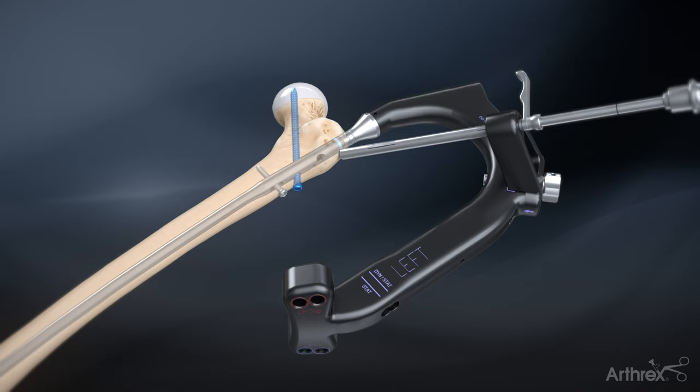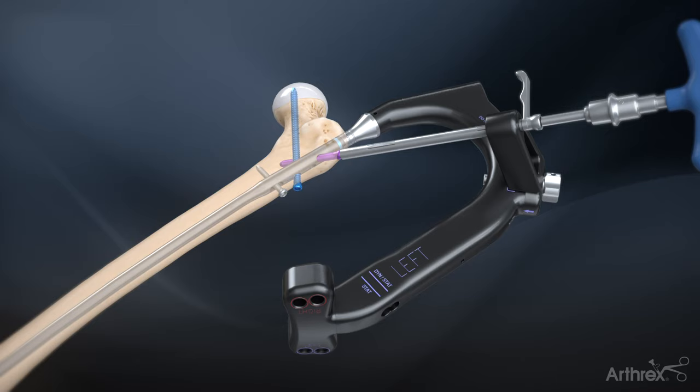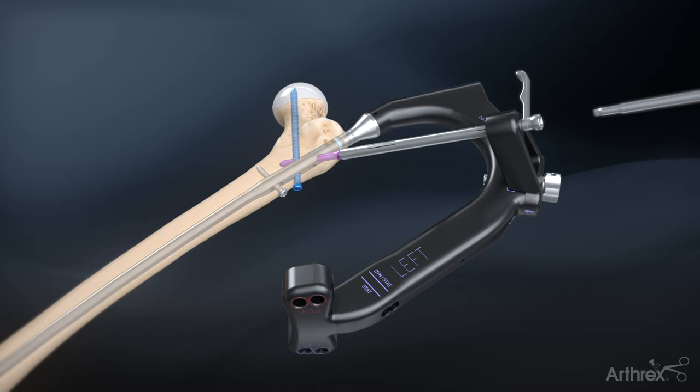Insert the 6.5 mm fully threaded cortical locking screw assembled with the captured hex driver through the screw sleeve until the laser mark is flush with the end of the sleeve. Remove the screw sleeve.